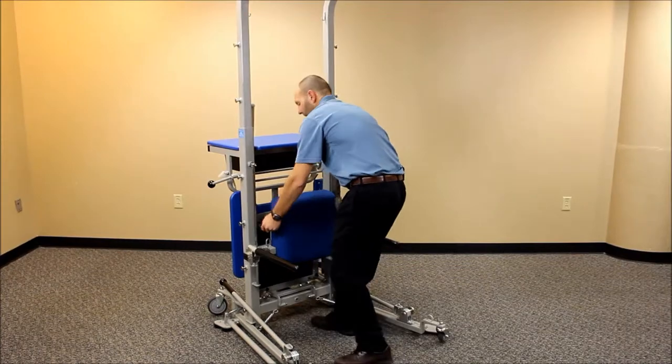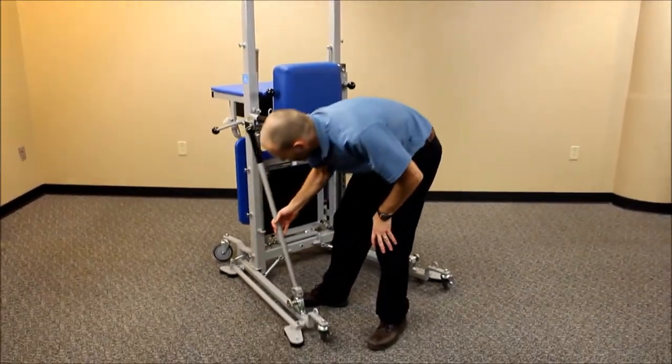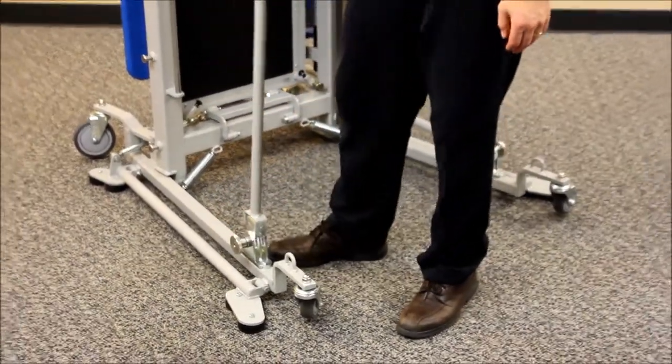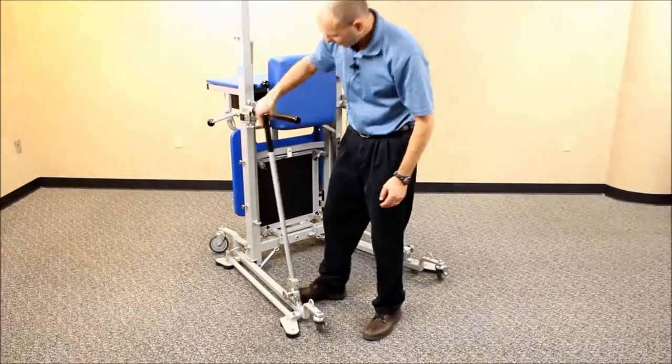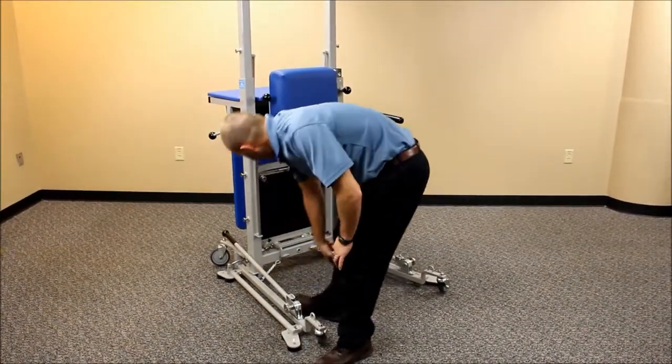One thing I forgot to point out: on the activity poles, there is an adjustment knob so you can adjust the tension to an appropriate level for each individual patient, by just turning that knob left or right to tighten or loosen it.